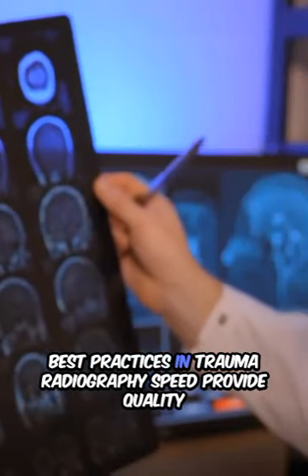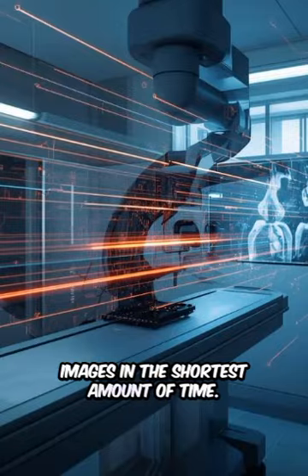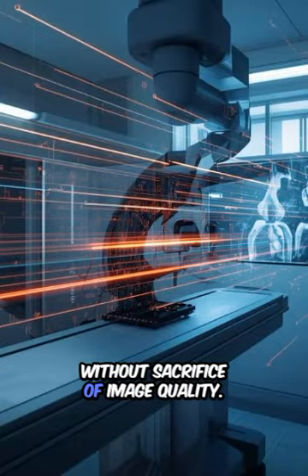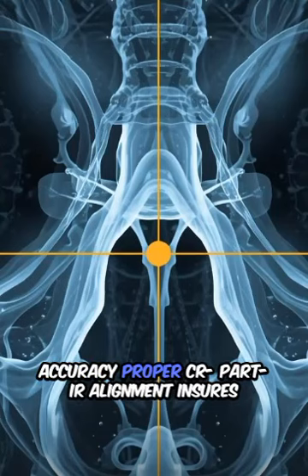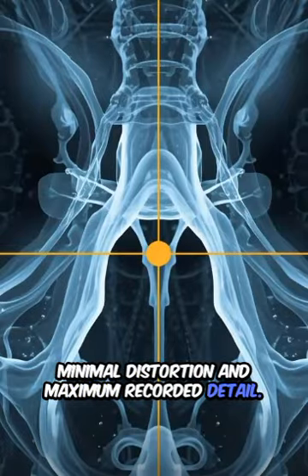Best practices in trauma radiography. Speed: provide quality images in the shortest amount of time. Exam efficiency can be increased without sacrifice of image quality. Accuracy: proper CR part IR alignment ensures minimal distortion and maximum recorded detail.